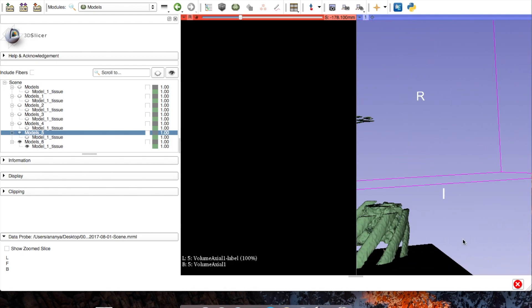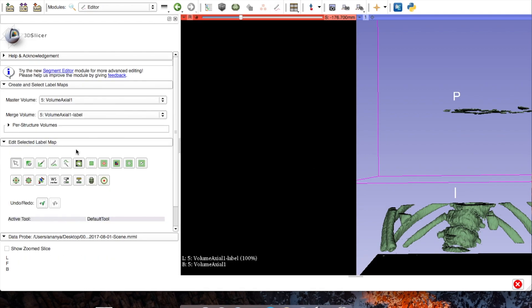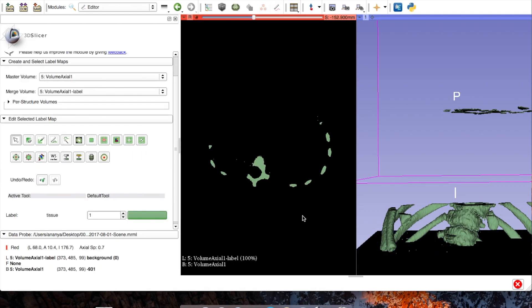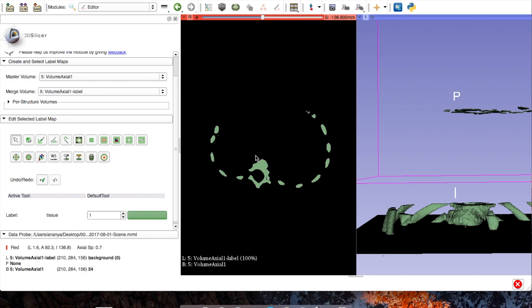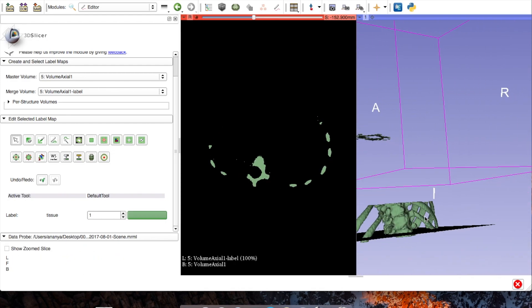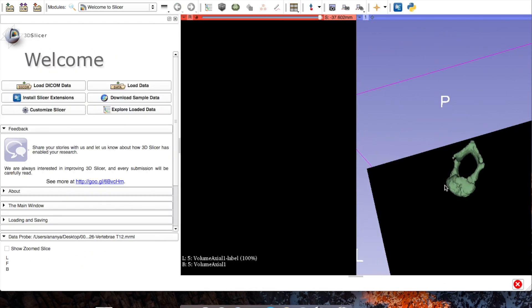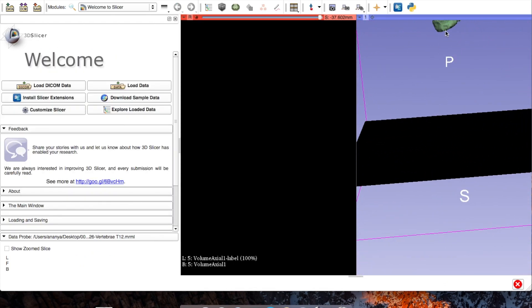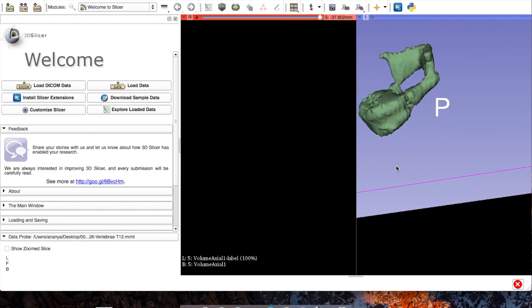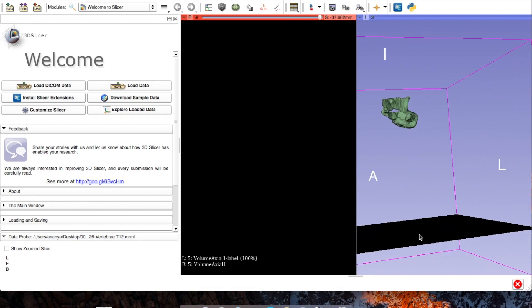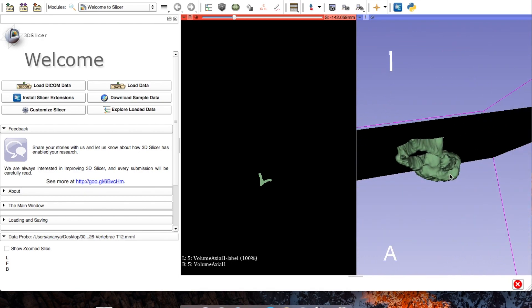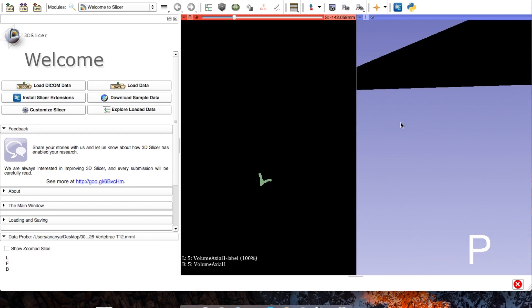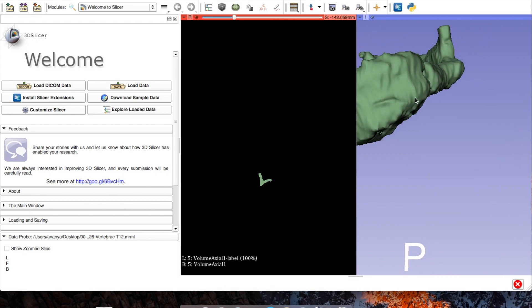Work your way down — in the axial view you can track where the vertebral bodies separate into two different ones and where your spinous process separates. Get rid of the ribs and work down into that. For time's sake, because it does take a very long time — but it's more of the same — you just need a high attention to detail. This is what one vertebra is going to look like. Always go back and smooth it out, and make sure to clear up any extraneous matter in the far right or far left corners, as it can affect any MATLAB code or other code you're running.